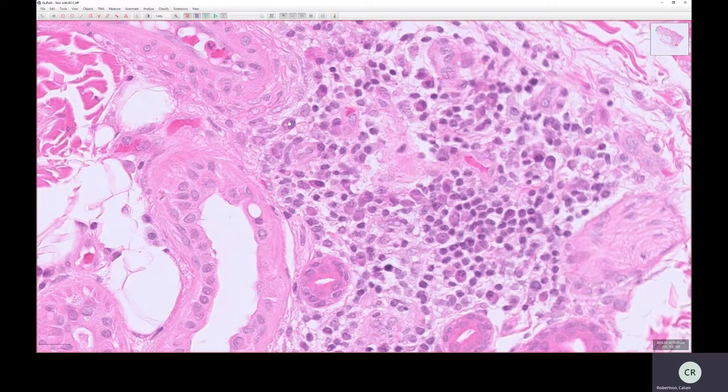And that's because in this cell, the eosin stains proteins pink. This is loads of proteins. So this is loads of immunoglobulin. And that's because this cell is a plasma cell, and its job, its purpose in life, is to produce immunoglobulin. So these produce antibodies. These are plasma cells producing antibodies. And they always have that look. They always have this clock-face nucleus, this perinuclear pink hof, and they're busy producing immunoglobulin. So that's a plasma cell.